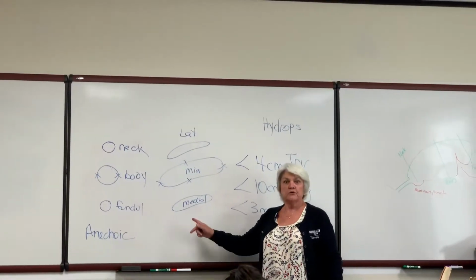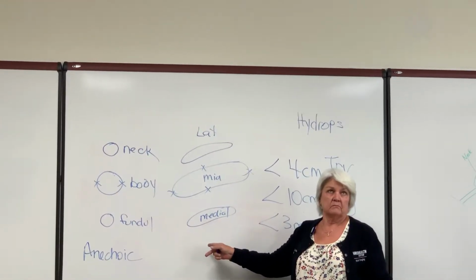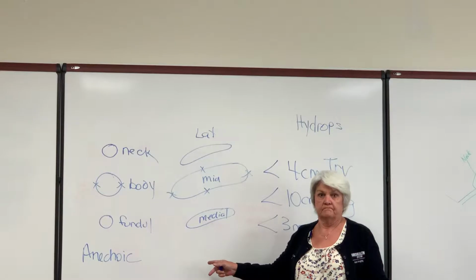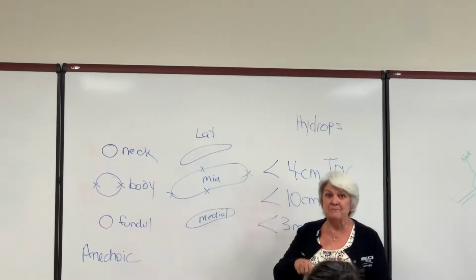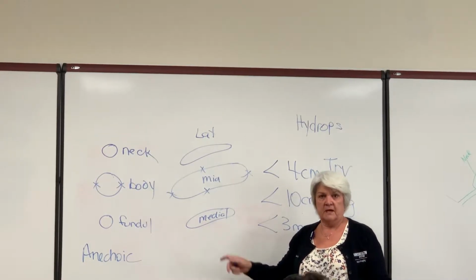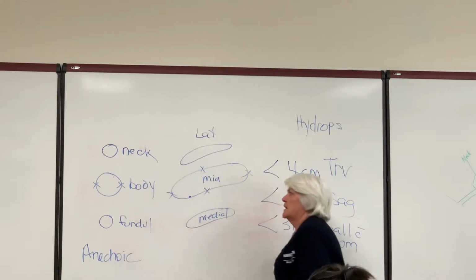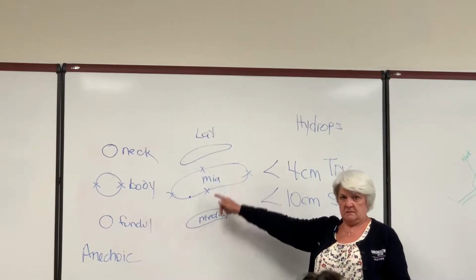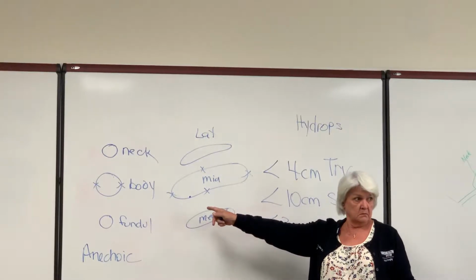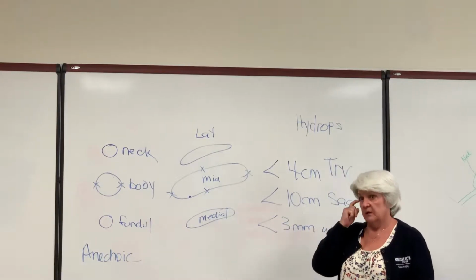Okay? If you're doing medial and you're really lateral, I won't know the difference. Okay? So be sure if you can't remember that you do this. Okay? Because I might have a polyp at my mid. Okay? A polyp is non-mobile. It will usually have a stem on it, so it will have color.